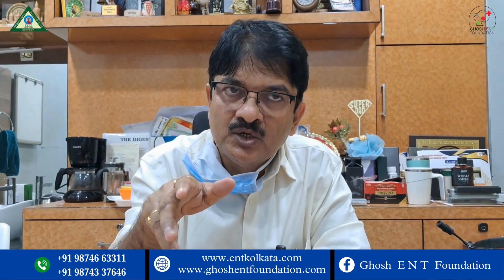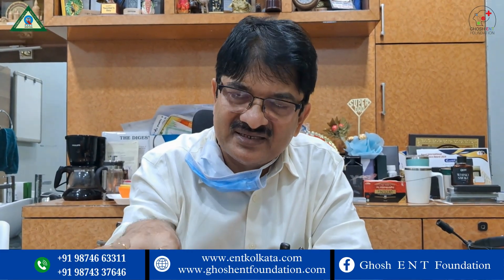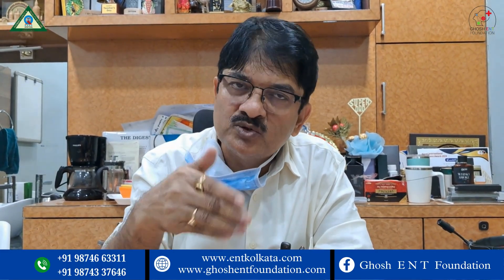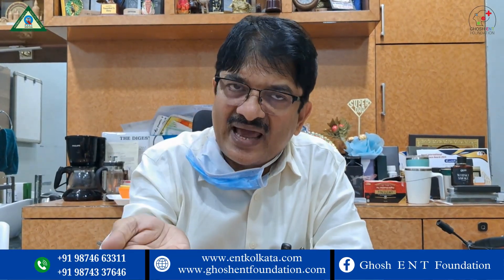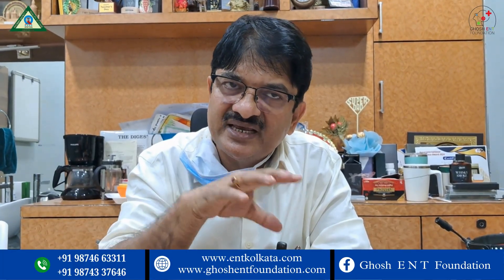The concha bone is there — that will be fractured — and the soft tissue, adipose tissue, all soft tissue will be debulked. The normal mucosa will be preserved but debulked and reduced in size as much as desired. This should be done with micro debriders.